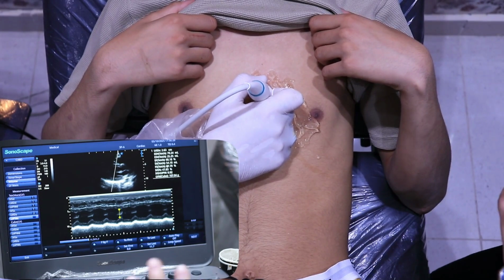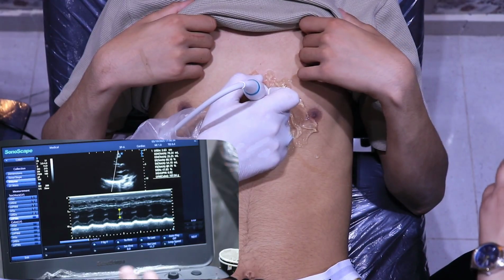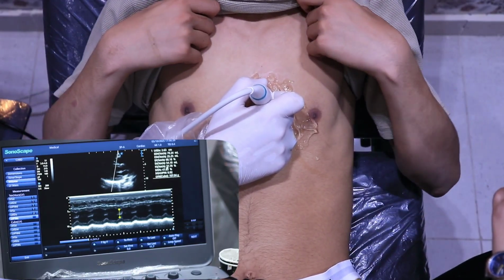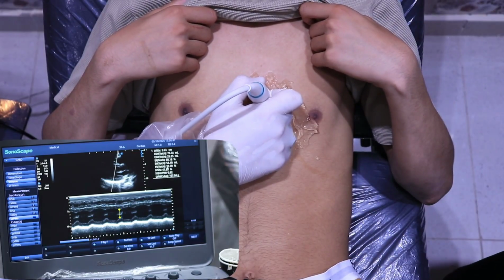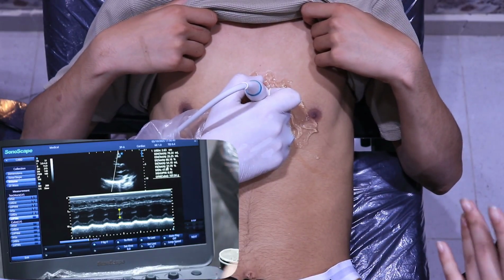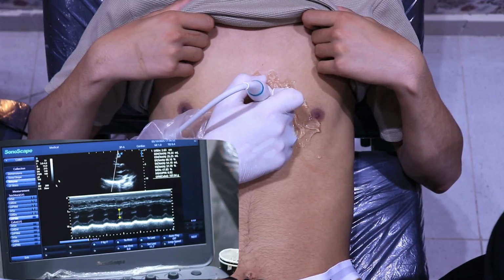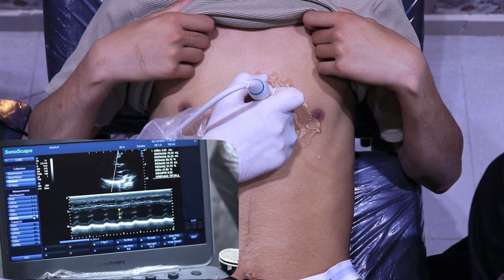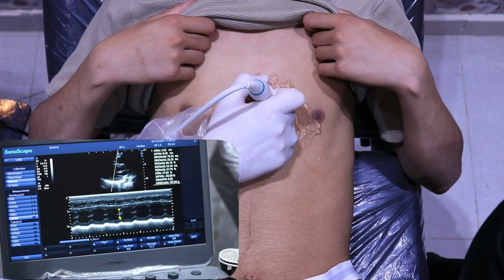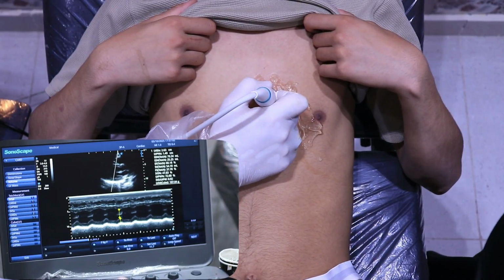الفراكشنال شورتنج نمبرز بس. The diameter during diastole minus diameter during systole divided by the diameter during diastole. So this is basically the fraction of shortening is 37%. This means that there is 37% shortening of the movement of the heart. Very good. طيب بعد كده هنشوف بقى ايه ال next measurement، ال posterior wall during systole اللي هي دي حضرتك. Okay, so we'll go for the posterior wall during systole from here till here, and this should be able to give us the left ventricular mass.